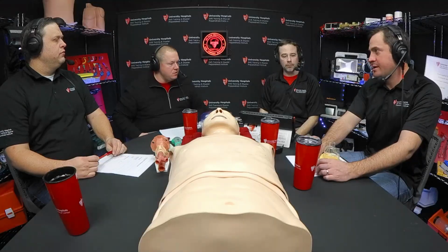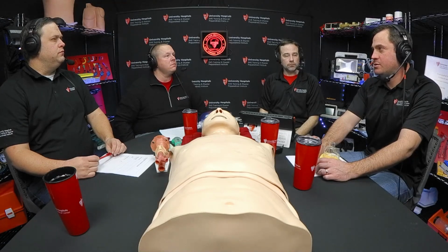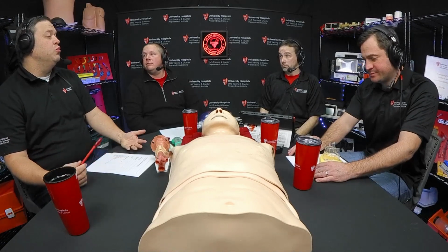You're not ventilating them as well. Yeah, you're making their chest rise, but in theory, you're not really ventilating that patient appropriately because you're lacking the appropriate BLS tools, rate, volume. A lot of these things go into it. Blebs, yes, it's a serious concern when you take that long. Subcutaneous emphysema, tension pneumothoraxes. Well, and if they have underlying lung diseases, which most of them are going to be, and that's why they're intubated, right? Correct. If they have COPD, you can trap air, and that happens with us, that they can just trap air and you're not ventilating anything.